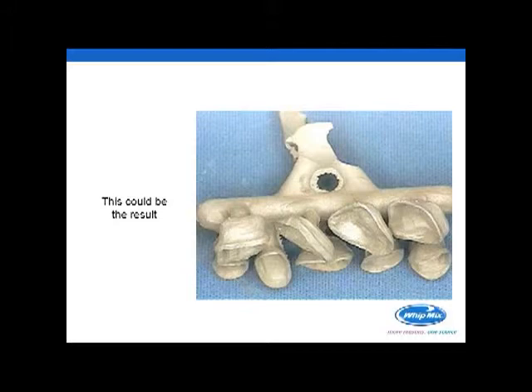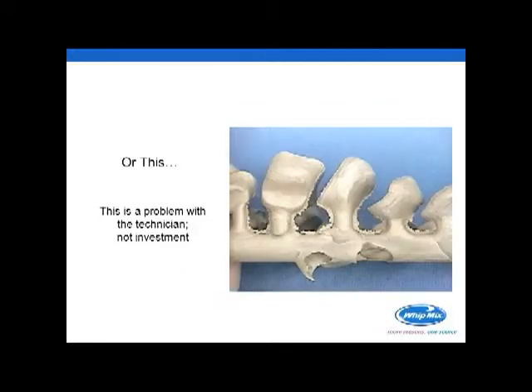You can see in this particular case how tiny the sprues are. Little tiny, less than 1/4 of an inch, most of them, puts this whole mass of wax too close together. They need to be extended a little bit. You can see the same thing is going on here, a little different casting, but that same finning routine. They're fairly close together and fairly short sprues. Just extending the sprues alone would have fixed this problem. And having one sprue taller than the next one would have fixed it even better by giving you variation and more support of your investment in between.